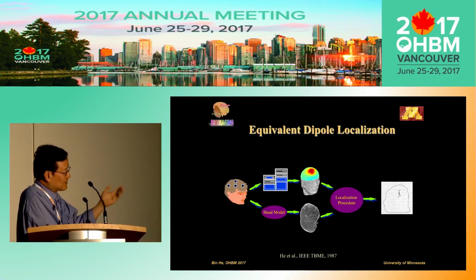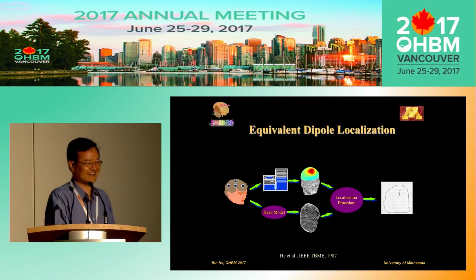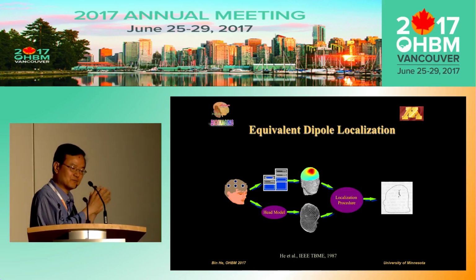So I try to use graphics instead of equations. This result I took from one of my own early papers, published in 1987. This is amazing. I cannot believe how many years I've been working on this problem, and you can guess how old I am. This is taken from my PhD dissertation at that time, and we proposed to use a boundary element model, although it's homogeneous, for an epileptic patient with an interictal spike. So you find the dipole from EEG, and in this case we used CT at that time, actually not MRI, because it was a very early time.